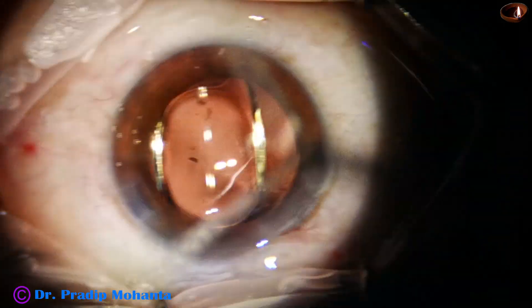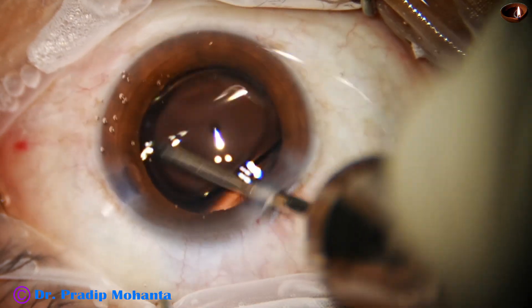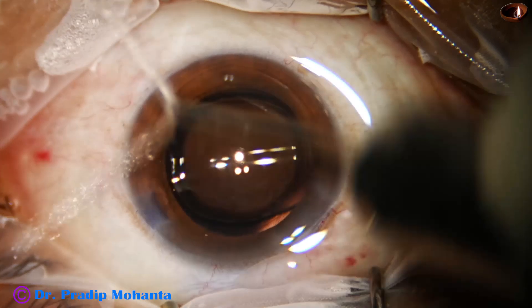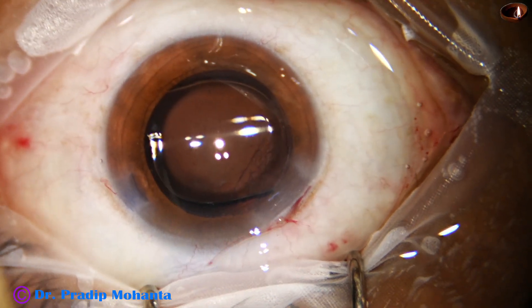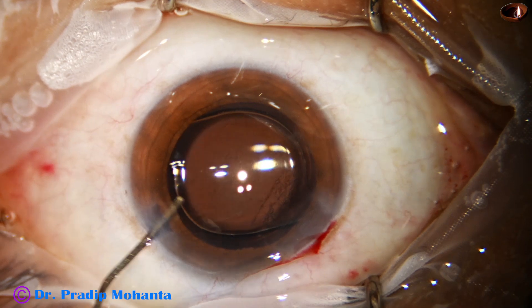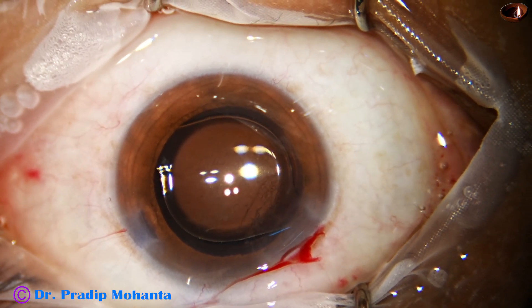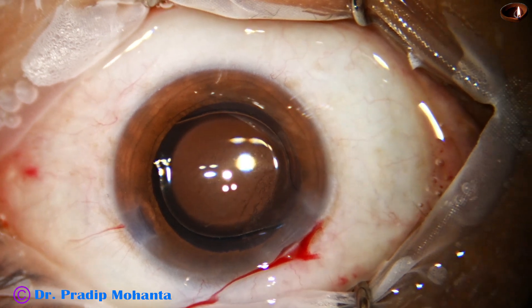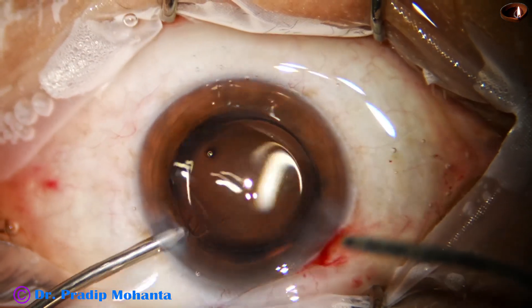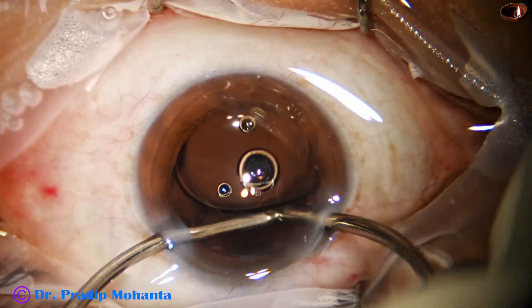If we use a B cartridge, compression of the optic of the lens is minimal and the optic remains in good condition. Sometimes there are cracks in the optic due to a very small cartridge. So it is better to use a B cartridge to implant intraocular lenses — this is my personal opinion.